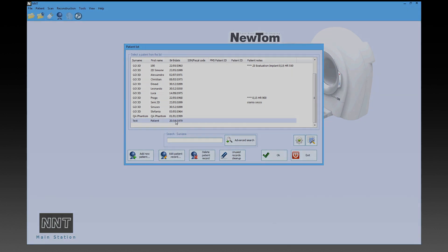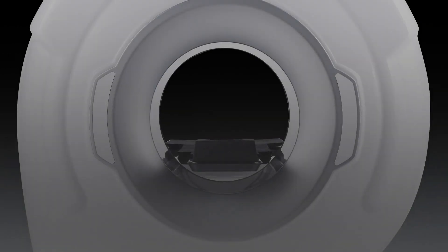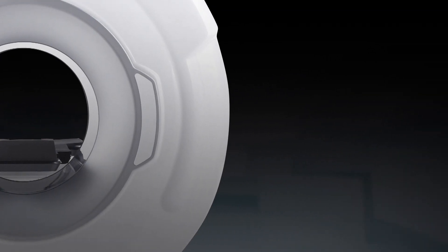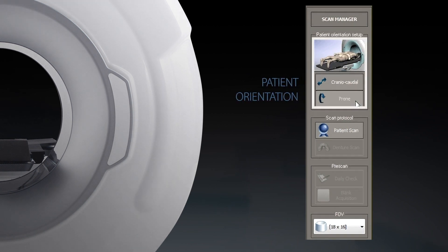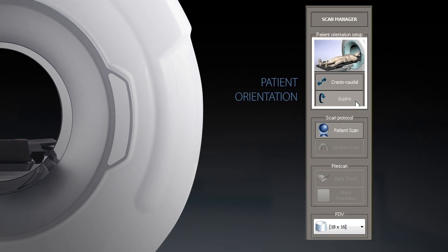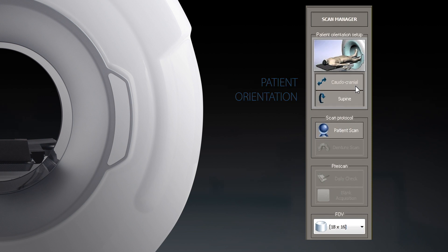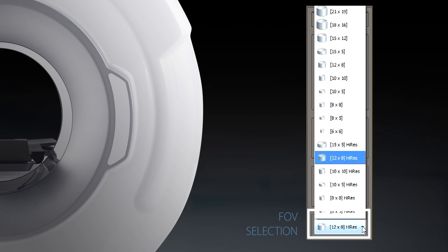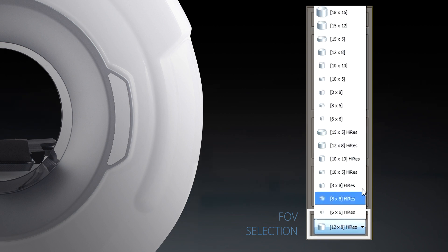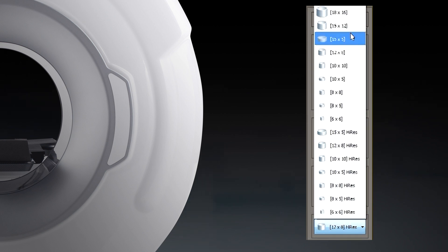Afterwards, the physician uses the scan manager window to submit to the software the patient orientation on the table and select the field of view to be used. Each field of view is associated with a resolution — standard or high resolution.